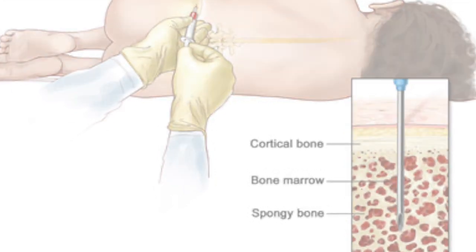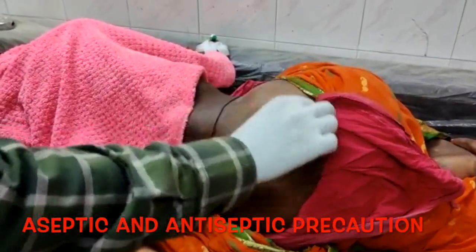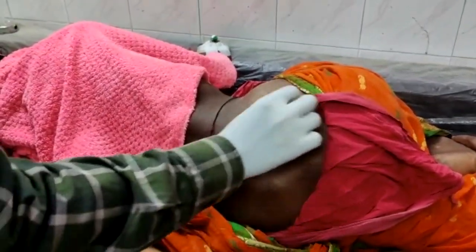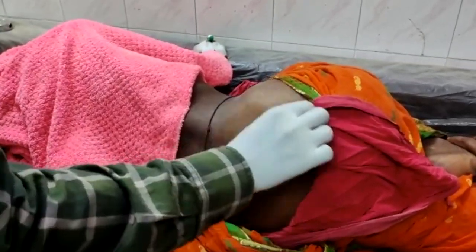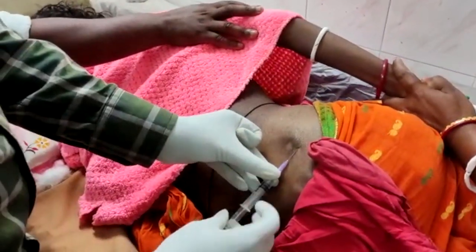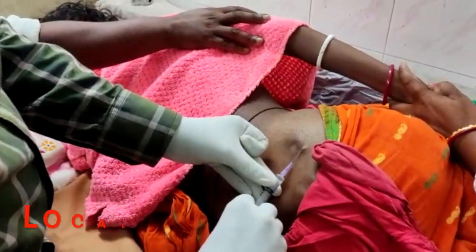The procedure has to be carried out under strict aseptic and antiseptic precaution. We use alcohol and betadine. We start cleaning from the center towards the periphery. We give three layers of protection: first a layer of alcohol, then a layer of betadine, and finally we clean again from the center toward the periphery with alcohol, as you can appreciate in this diagram. After having localized the posterior superior iliac spine, we now give local anesthesia.